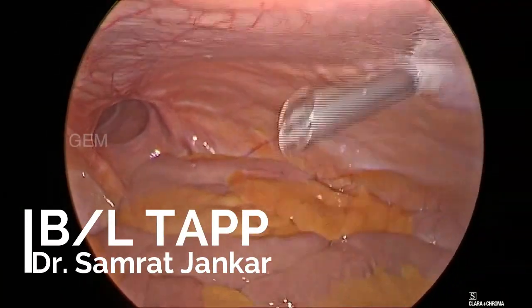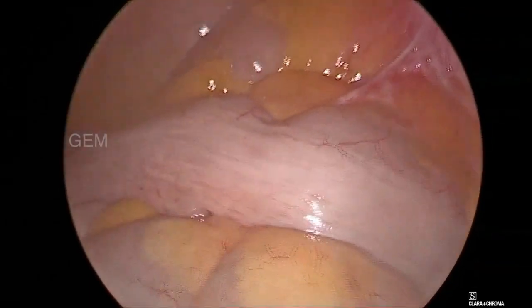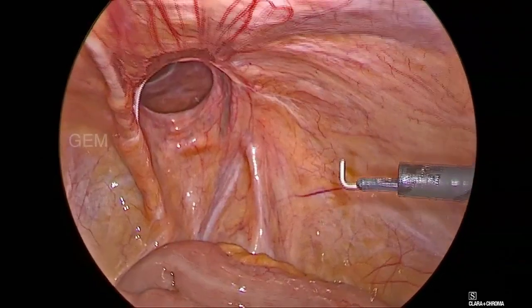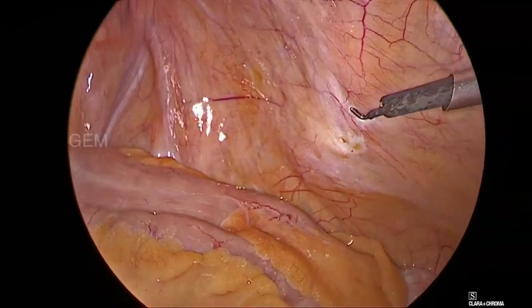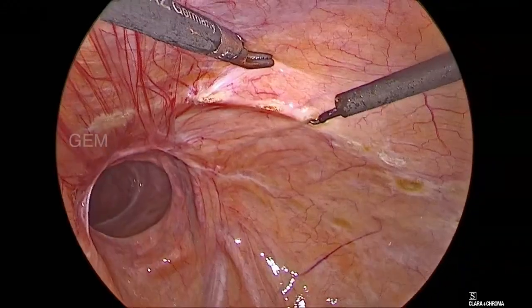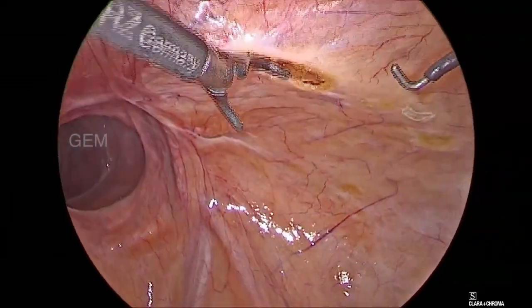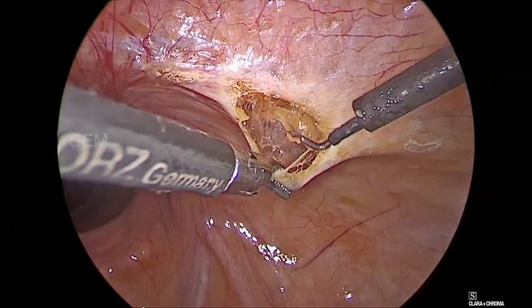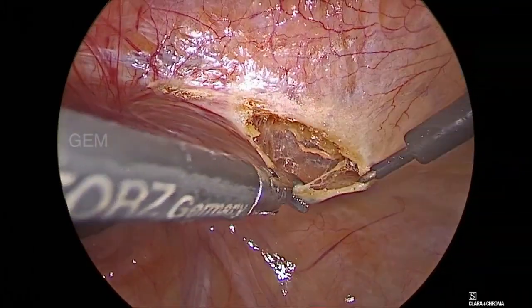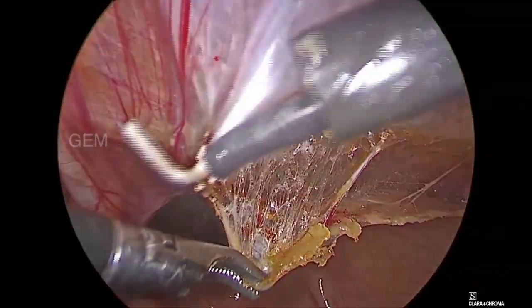This is a case of bilateral TAPP done for a large direct inguinal hernia. Patient age is 65. We have placed a supraumbilical port as a camera port and both side mid-clavicular line ports as working ports.